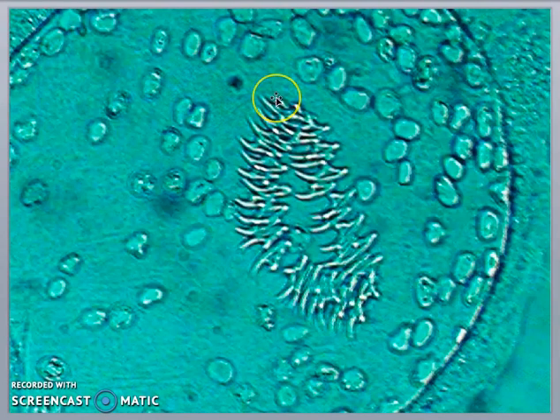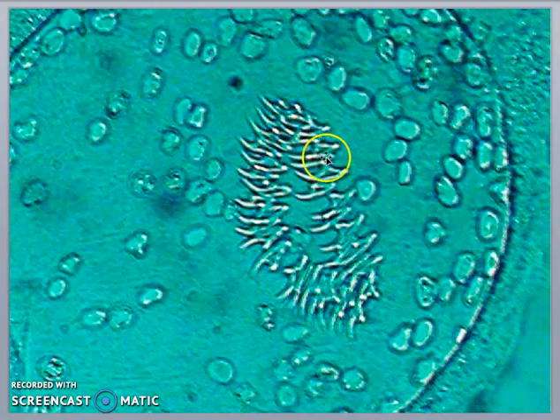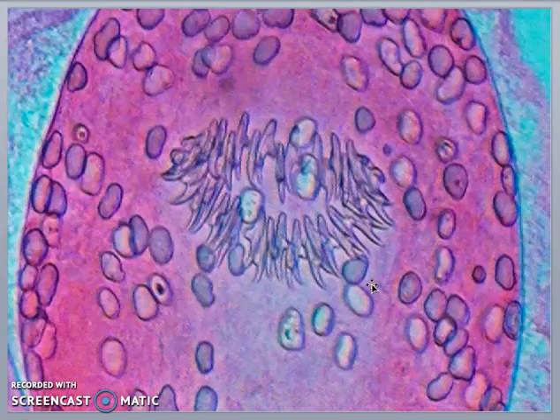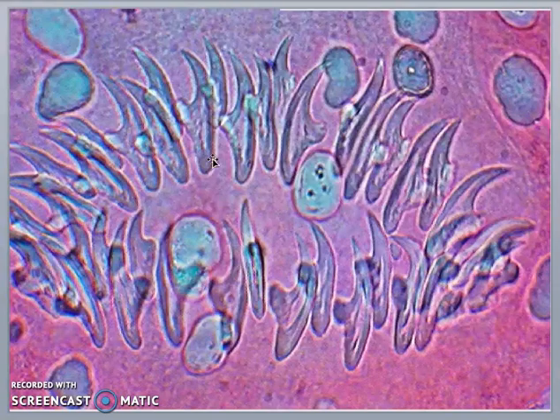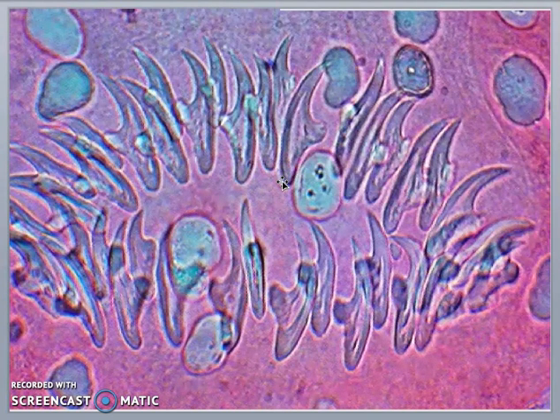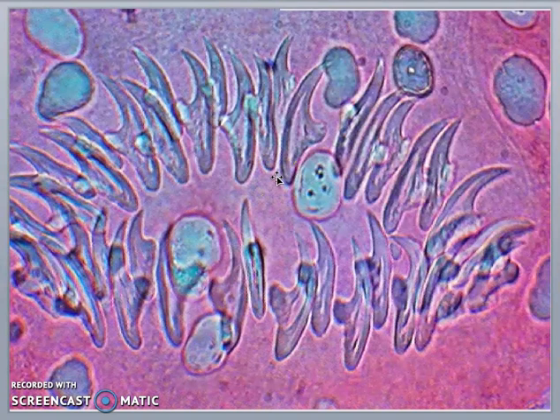The outstanding feature of the protoscolices is the rostellar hooklets. There are two rows of rostellar hooklets present within the protoscolices, clearly visible in the eosin preparation. Higher magnification reveals the Arabian poniard-shaped hooklets. These hooklets are very helpful in the diagnosis of hydatid disease in humans.